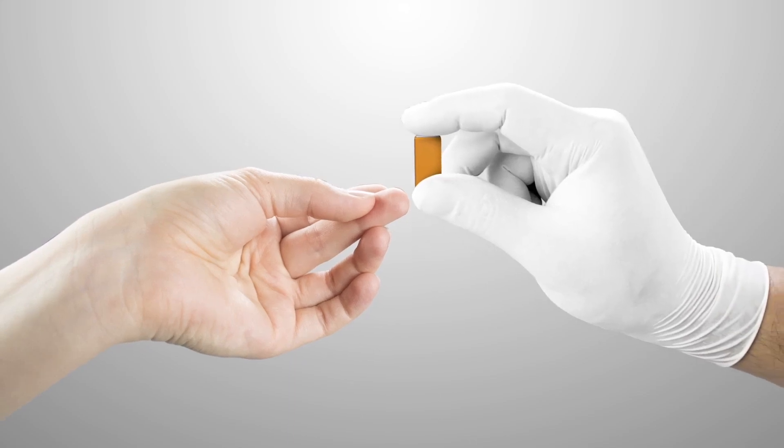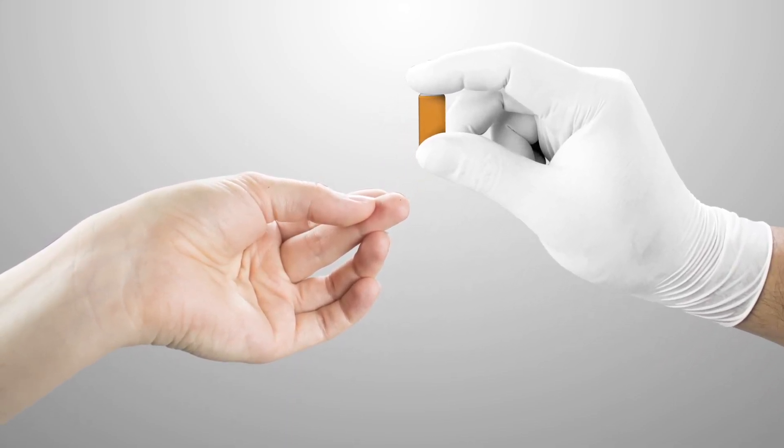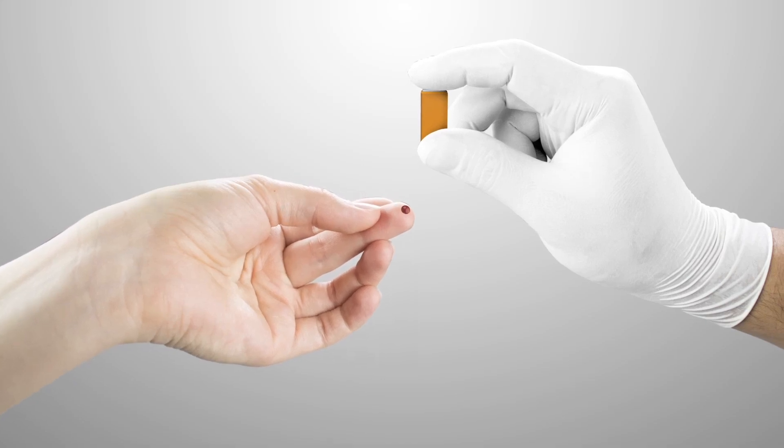Do not lance finger until meter display reads apply sample. Use 21-gauge lancet. Gently squeeze finger to produce a bead of blood.